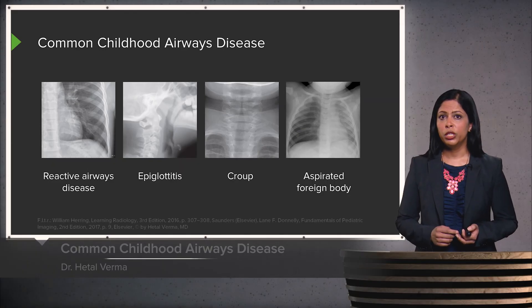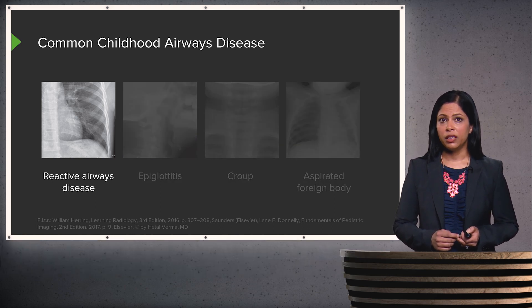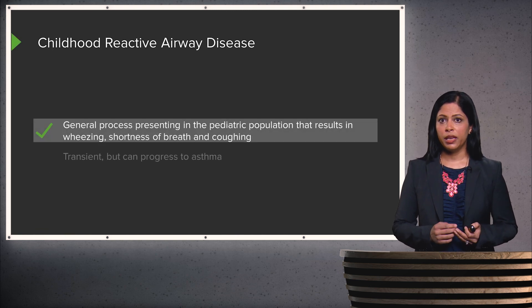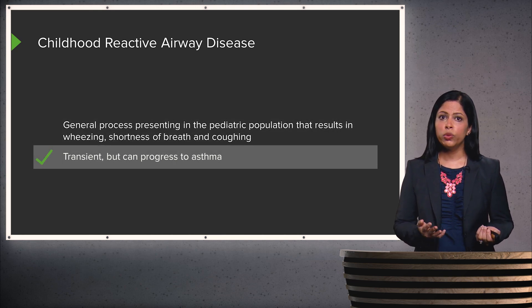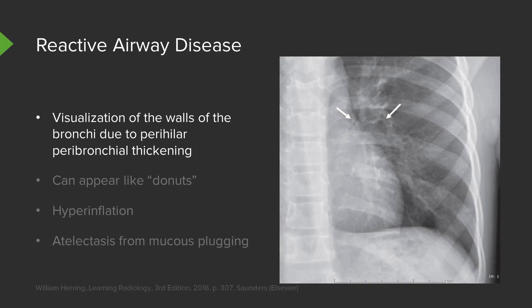Common childhood airway diseases include reactive airway disease, which is very commonly seen in kids. It's a general process presenting with wheezing, shortness of breath, and coughing. It's usually transient but often can progress to asthma. With reactive airway disease, we can see the walls of the bronchi in the perihilar region due to peribronchial thickening. You can see the lucent bronchi and the thickening of the walls around them, appearing like donuts in the perihilar region. Patients also have hyperinflated lungs and significant mucus plugging, which can result in atelectasis.